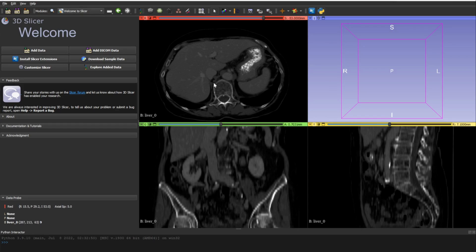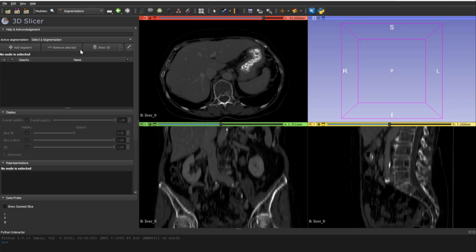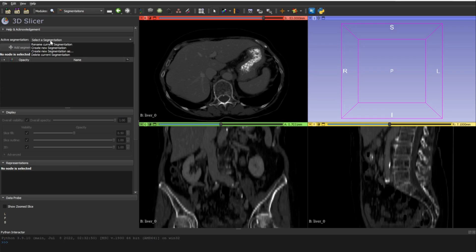Whenever you have your volume opened, you need to go to Segmentations. Right now we see nothing here because we don't have any segmentation file or masks yet. So we need to create a new segmentation — go to 'Select Segmentation' and click on 'Create New Segmentation'.